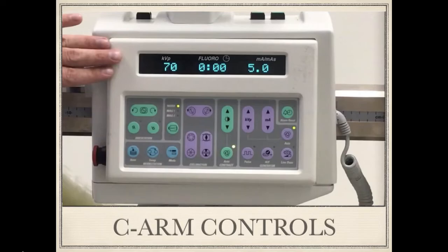In the lower end of the same box, you've got three more buttons. The first one says pulse, so this is using a pulsed beam, and this reduces the radiation exposure significantly. The other corner button is low dose. Again, this is something we use quite often to reduce the radiation the patient is being exposed to. And when you use this button, it automatically drops the MA to half or even more than that.